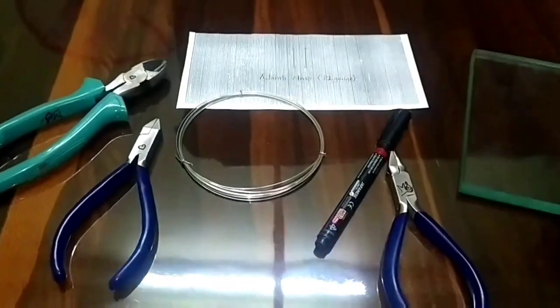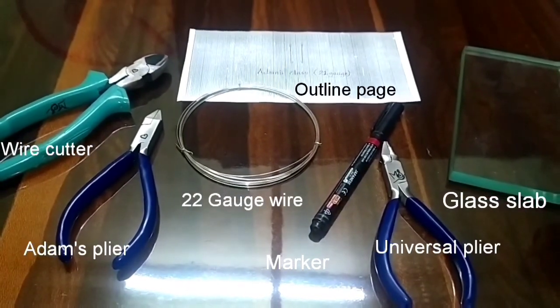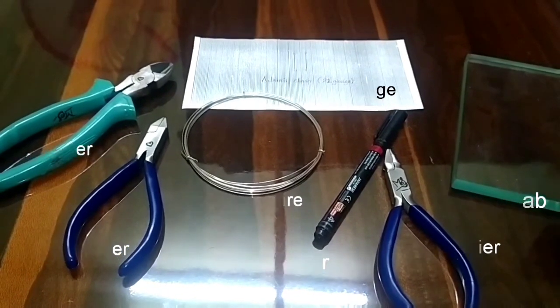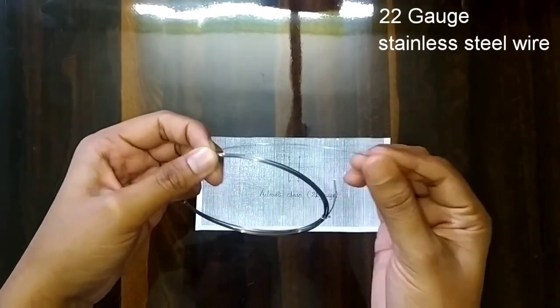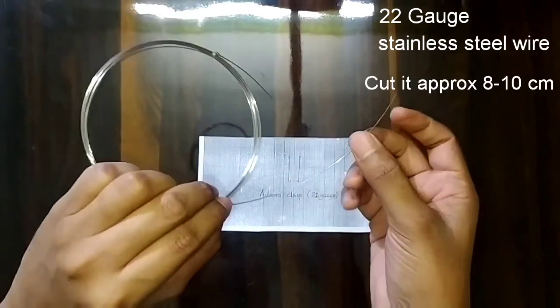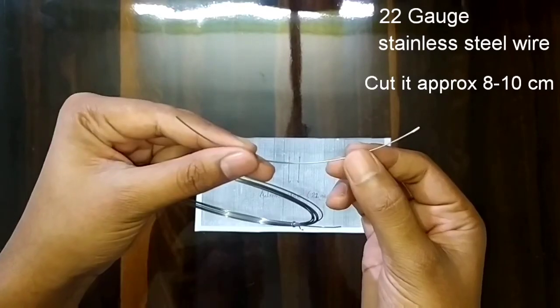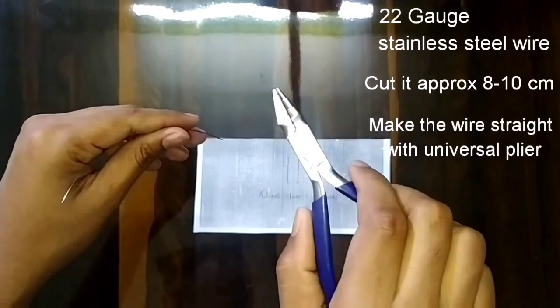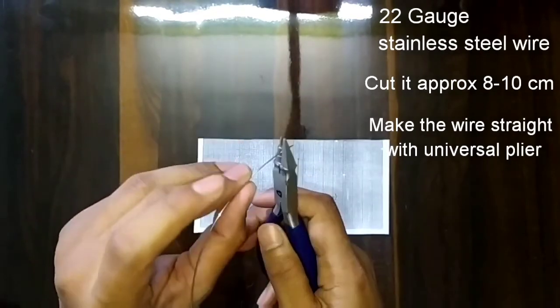These are the instruments required. First of all, we will take the 22 gauge stainless steel wire and with the help of the cutter, we will cut approximately 8 to 10 centimeter wire. With the help of the universal plier, we will straighten the wire.